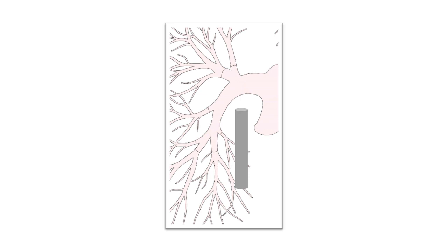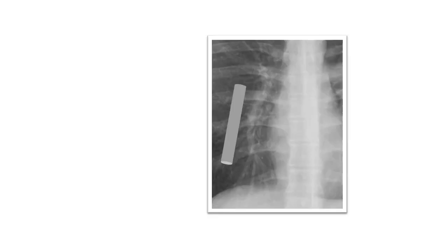Blood vessels have the shape of cylinders and course in various directions. If the course of the blood vessel is vertical, then we can predict that the radiological shape will be a rectangle. On this x-ray examination, adjacent to the right heart border, we see vertical white rectangles, which represent branches of the right pulmonary artery.